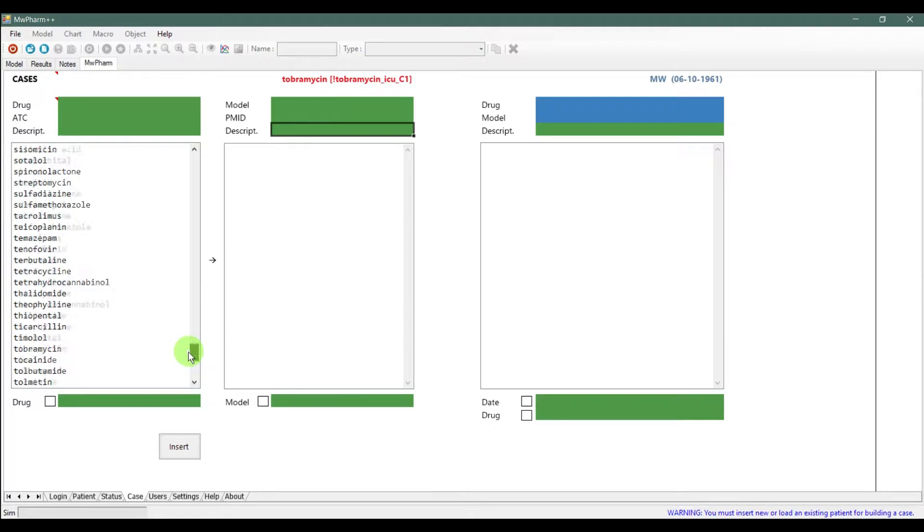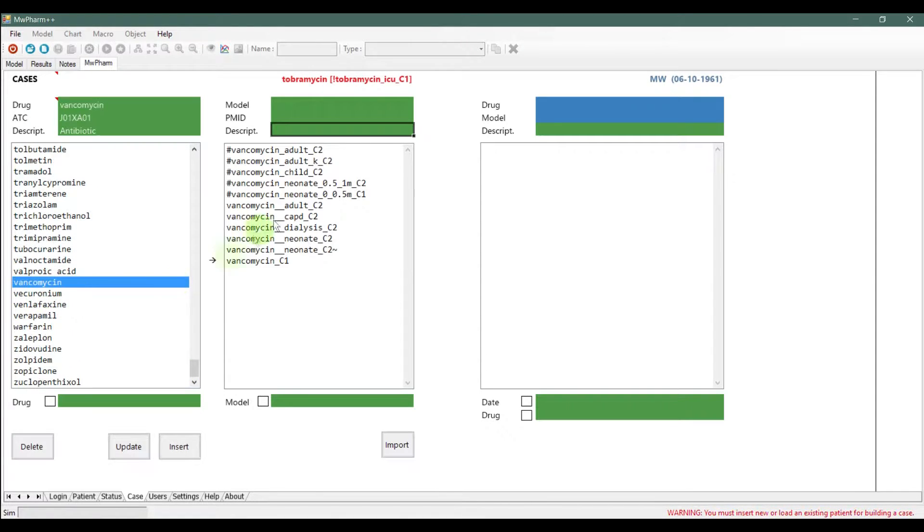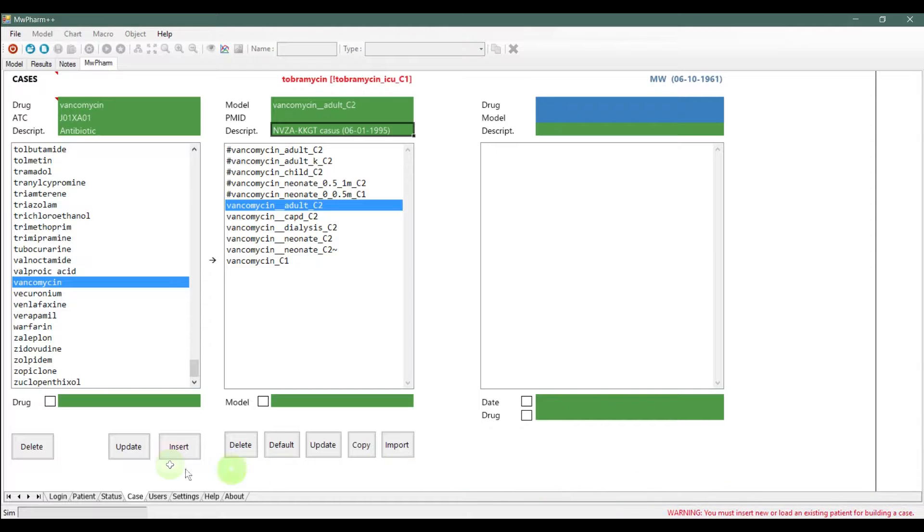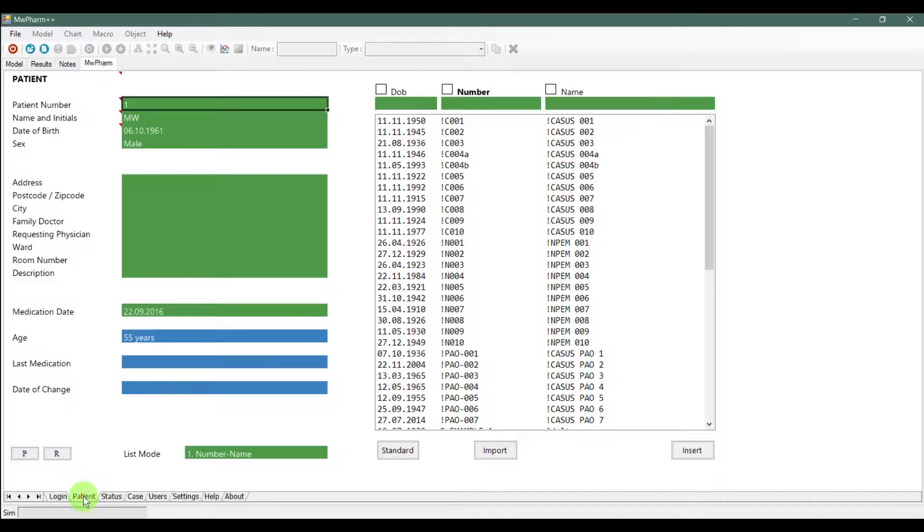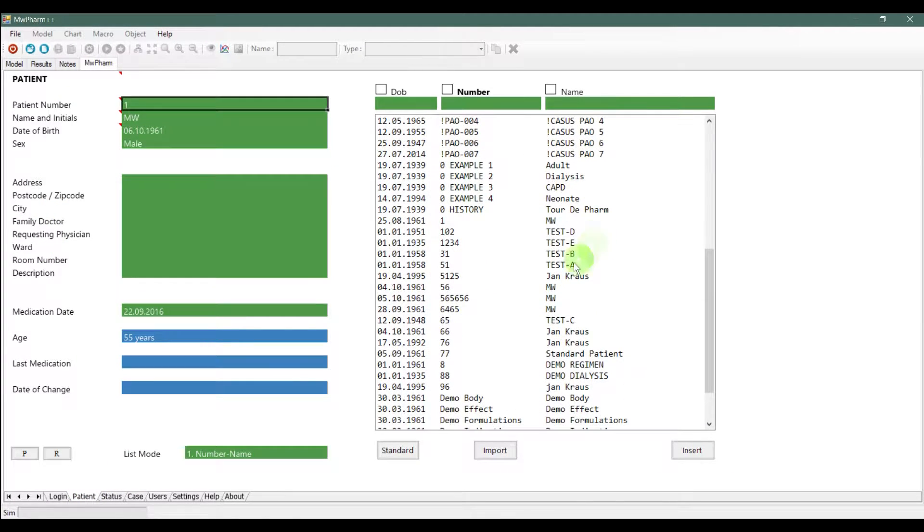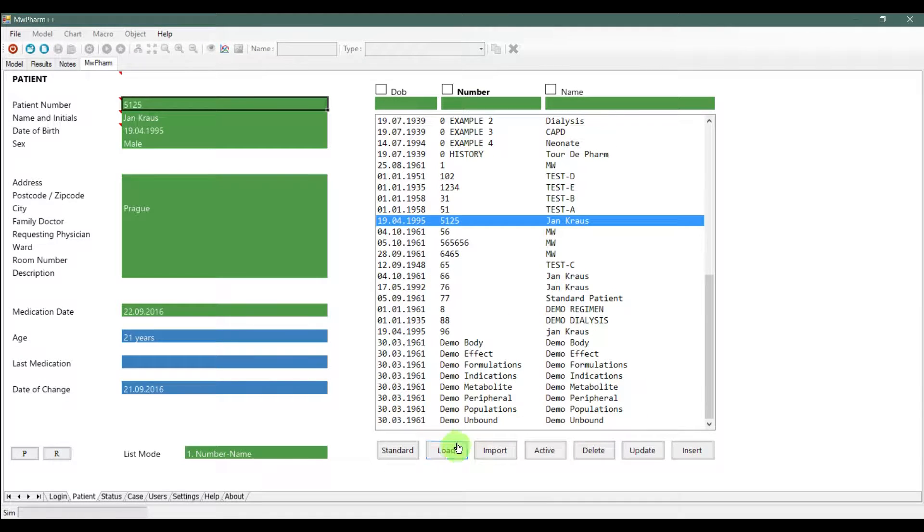This step is made for selecting the drug you want to use on your patient. As you can see down below, software warns us that we have currently no loaded patient, so we can't build a case. So, go back to the patient tab and load or create a patient as we learned it last time.